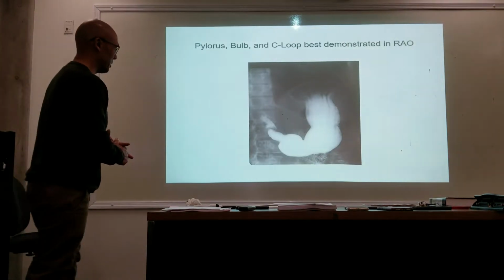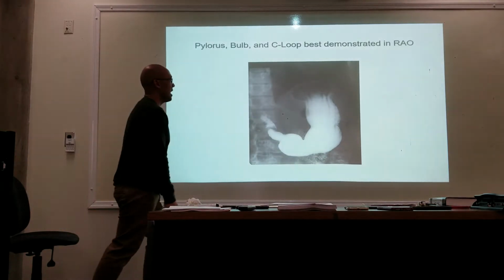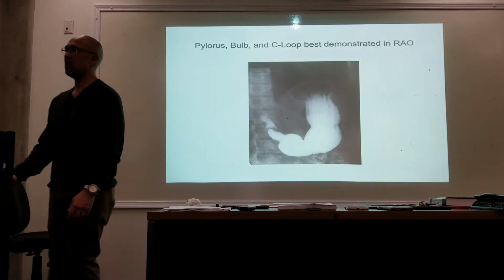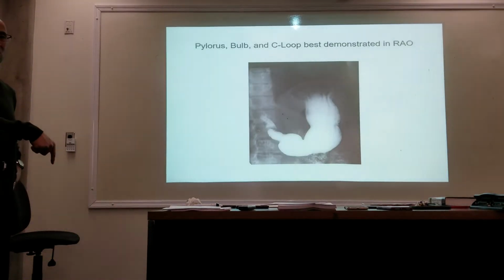The pylorus and the pyloric bulb and the C-loop is best demonstrated in the RAO position. RAO position. That is a test question.